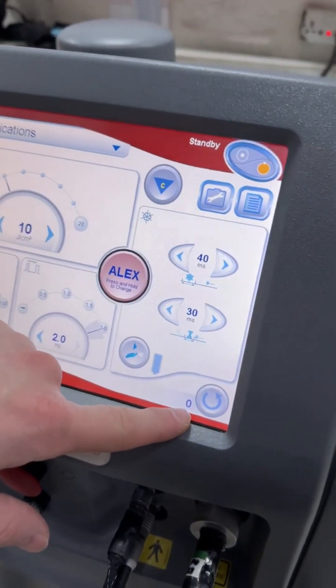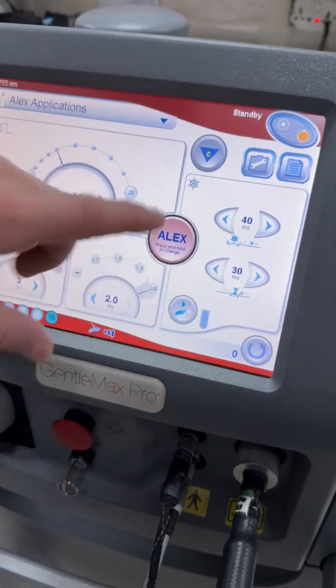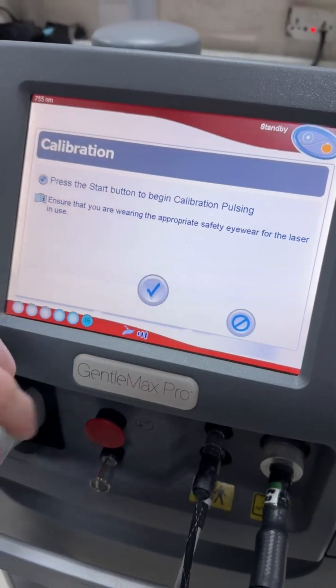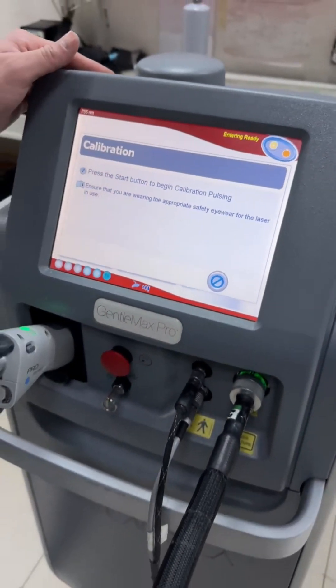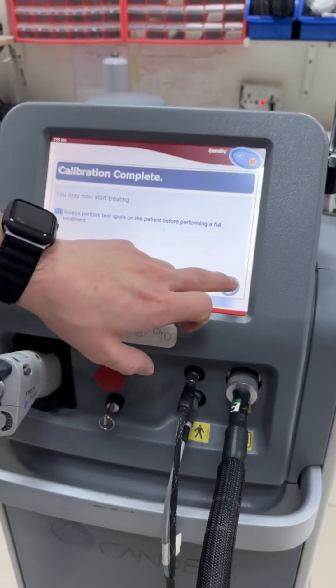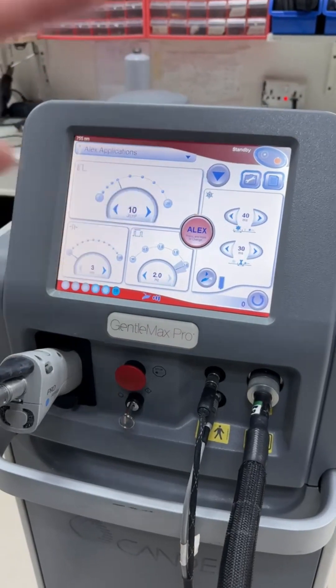This is the counter reset button, which resets the number of pulses to zero. Now we will carry out a calibration to use the machine. The calibration takes around 30 seconds. As you can see, the calibration is completed and now we are ready to use it.